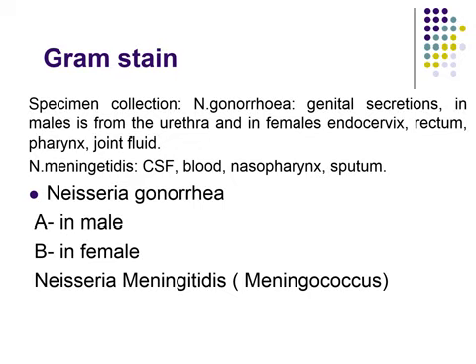Another test used to diagnose disease caused by Neisseria species is the gram stain. One of the most important tools for diagnosis of gonorrhea caused by Neisseria gonorrhoeae is the gram stain. In males, gonorrhea is represented by urethral discharge.